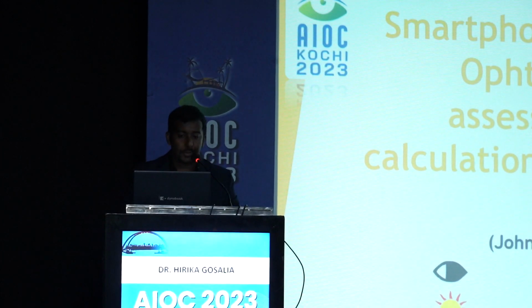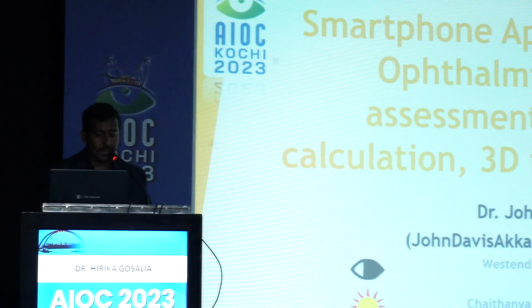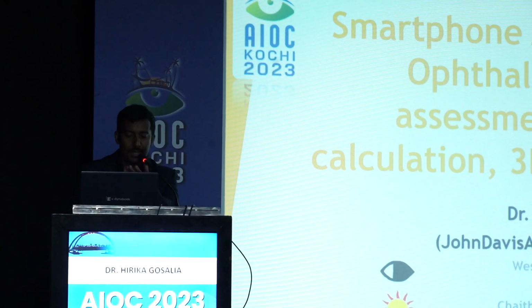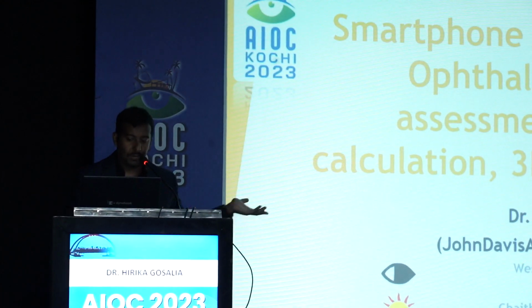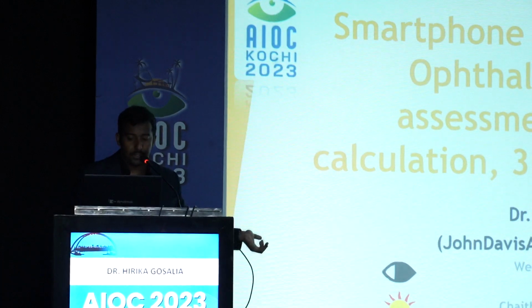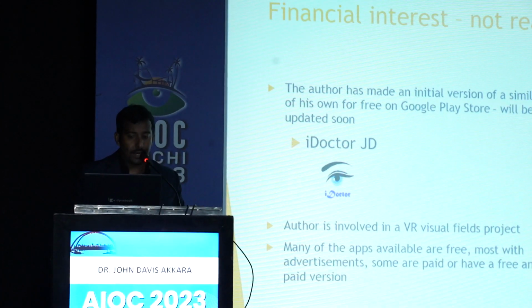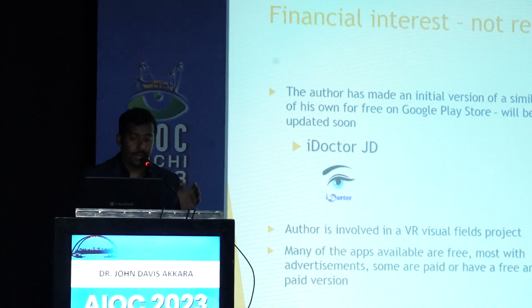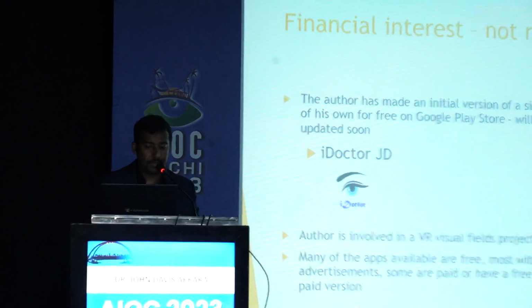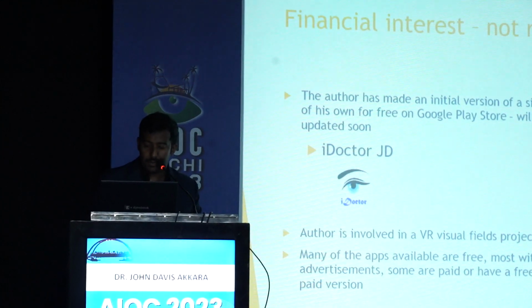So I'm going to talk about the smartphone apps for ophthalmologists, which can be used for all these assessments of the eye, calculations, 3D imaging, and so on. I'm Dr. John Davis Akkara, Western Eye Hospital, Kochi, and also Chaitanya Eye Hospital, Kochi. Financial interest: I have made some of the apps mentioned in this, but they are free. You can download them from the Play Store for free. So practically no financial interest, but they are made by myself.